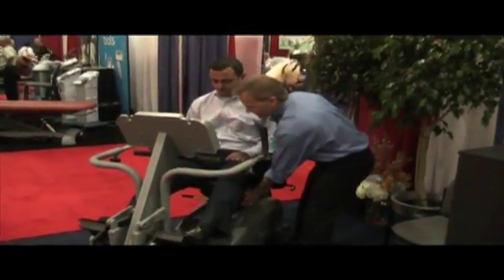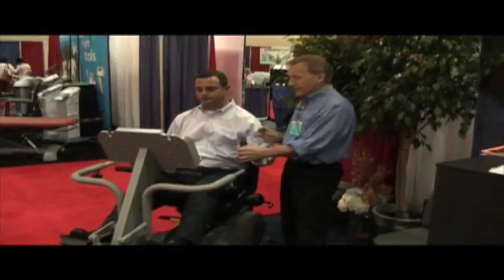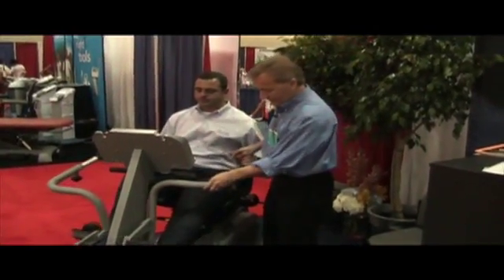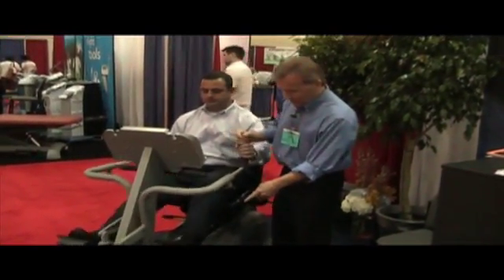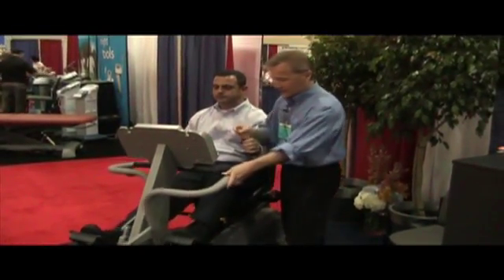You adjust the seat length simply by moving the seat forward and back. There are arm grips that can be adjusted to the correct position. At the feet, you can pedal in two directions — you can go forward or change the muscle groups and go in the other direction.